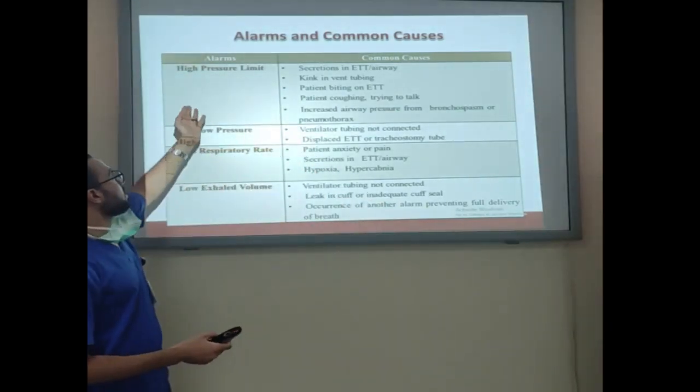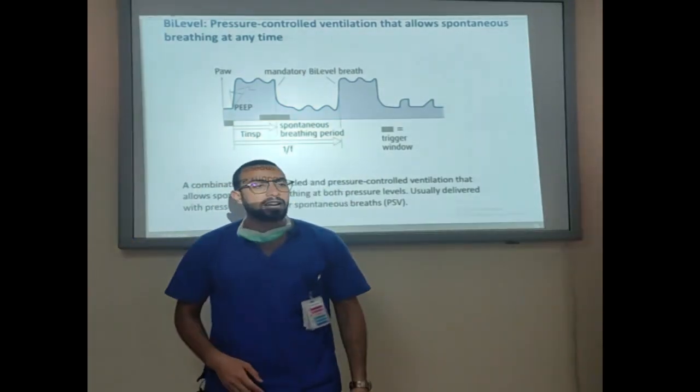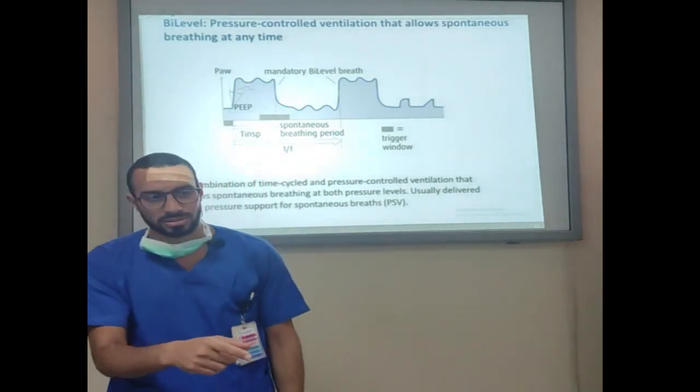Number one, you can see sometimes high pressure alarm, and let me just ask you, if you see high pressure alarm, what can you expect in the patient? High pressure.